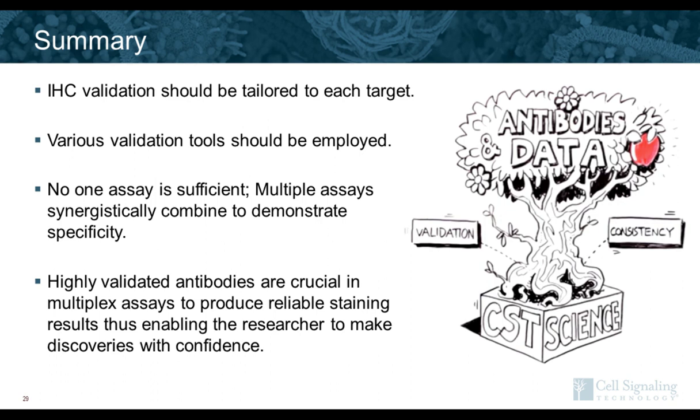I have an antibody that does not work well with DAB, but has been shown to work with directly conjugated secondary fluorescent antibodies. Will it work with OPAL? In this instance, when I see that it's working with a secondary fluorescent antibody, I'm surprised that it's not working with DAB. But that being said, since it's working with your secondary conjugate, and OPAL is actually amplifying it even more than your secondary conjugate, then you should be able to get amplification of that antibody, and so it should work with OPAL.